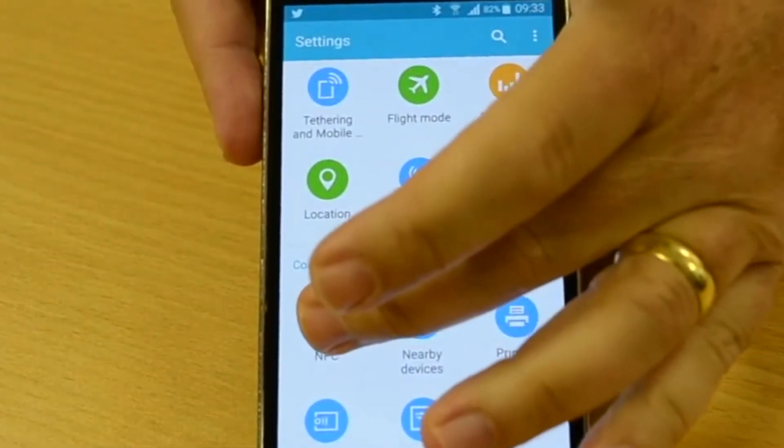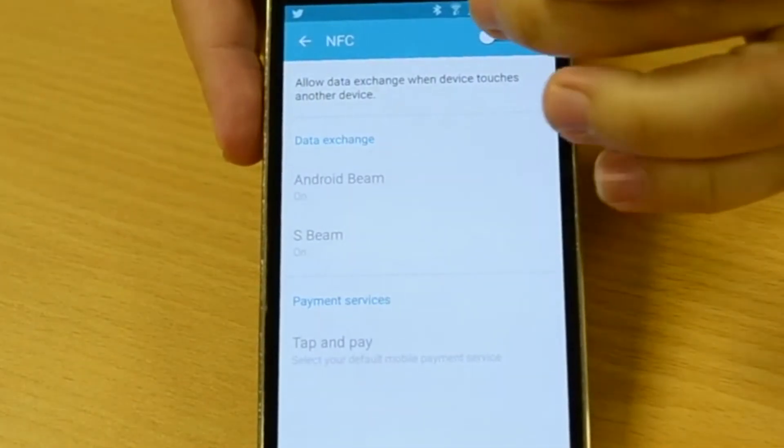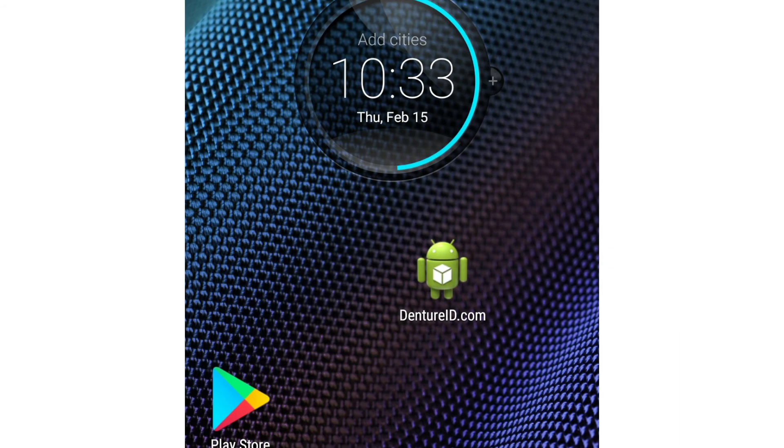To use an Android-enabled smartphone, go to settings and activate NFC (near field communication). Then go to the Google Play Store and download the DentureID.com app.